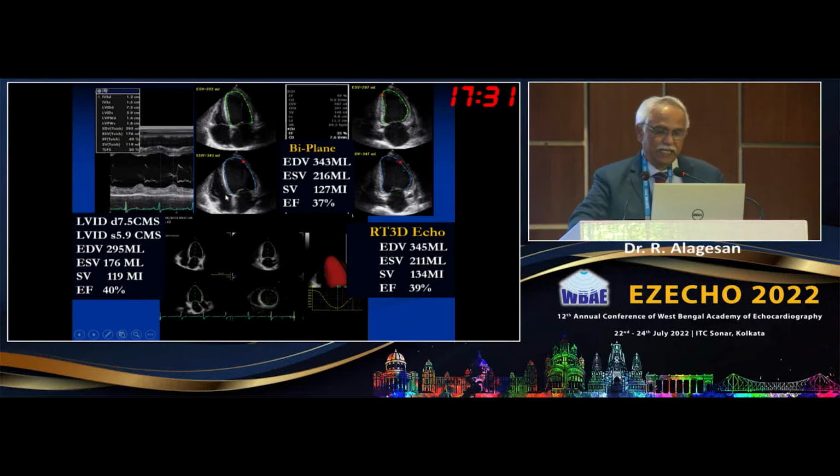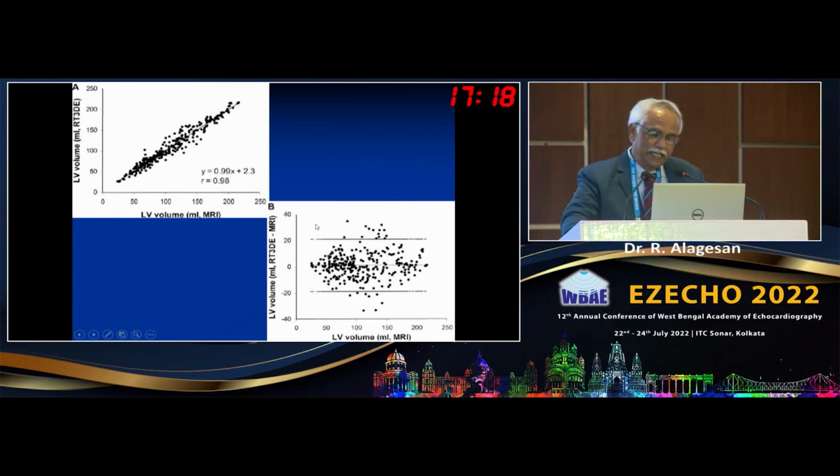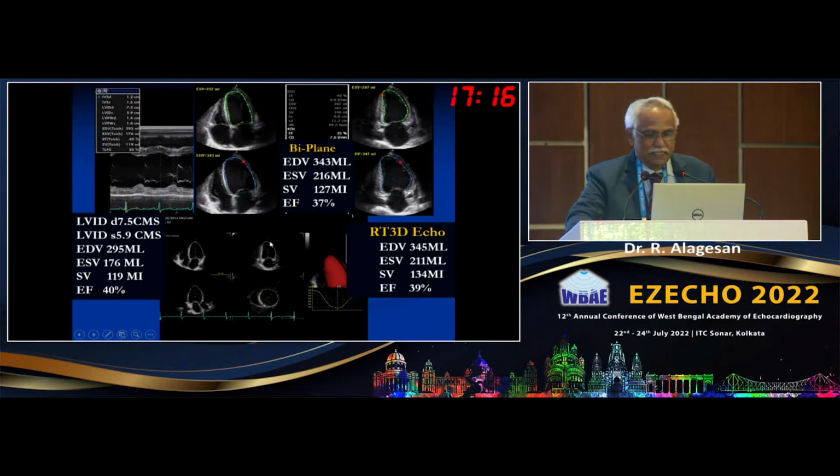The contrast-enhanced left ventricular volume obtained from the 2D is almost equal to the one obtained from the three-dimensional echocardiogram. Only thing is, when the endocardium is not clearly seen in the three-dimensional echocardiogram, it is better not to do the volume calculation from the 3D, and use the 2D with the contrast as the guideline for measuring the volumes and the ejection fraction.